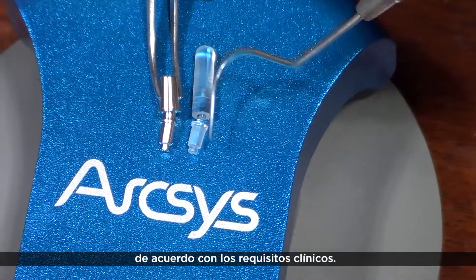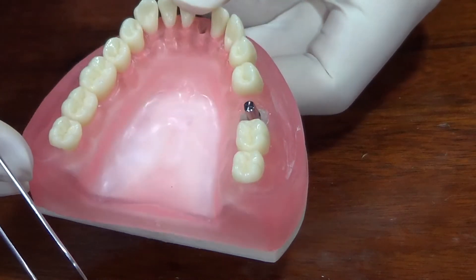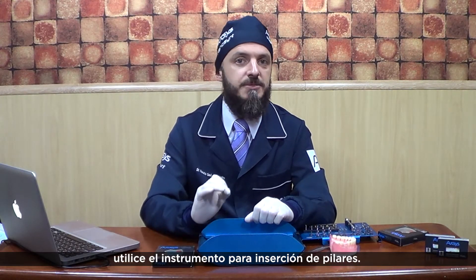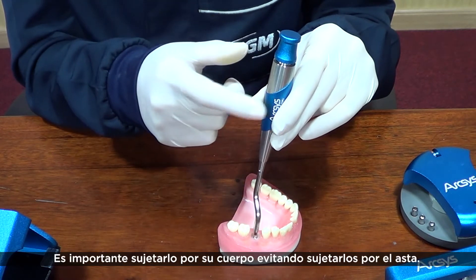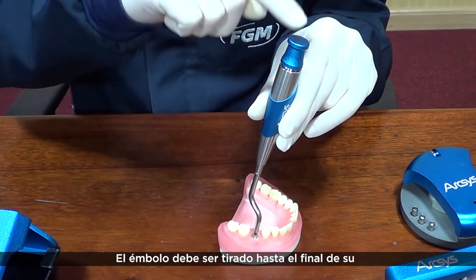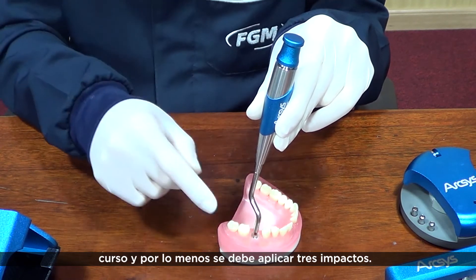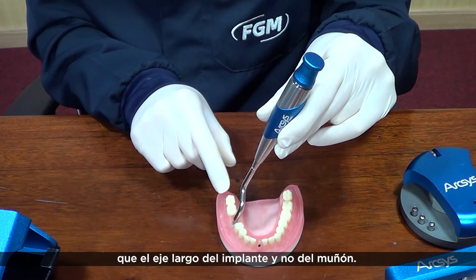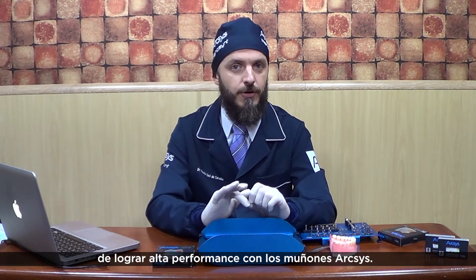Now we have to customize the abutment according to the clinical demands. For a complete and safe installation, use the abutment placement tool — a kind of hammer developed specifically for this goal. It's important to hold it by its body, avoiding holding it by the active stem. The pole should be pulled to the end of its extension, and at least three impacts must be accomplished. It's also important to direct it to the implant long axis and not to the abutment axis. Following these guidelines, you will be able to reach maximum performance with the Arcsys abutment.